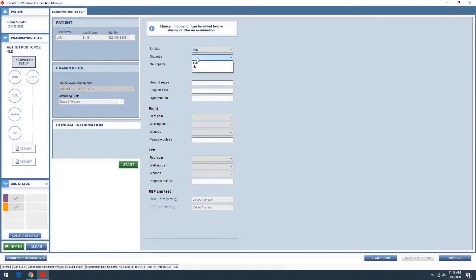Patients' medical background can be filled in and this information is included in the final report.